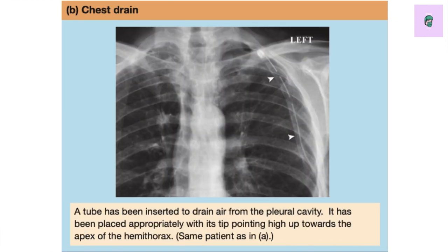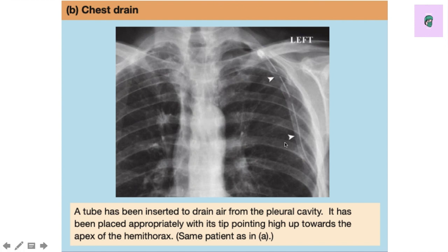Next is the chest drain. These days exams tend to ask a lot of equipment-related questions — pulmonary valves, aortic valves, mitral valves, and chest drains — to assess your clinical exposure. This has been more dominant since the August 2020 FMG exam. You can see the tip of the drain here, and the multiple holes indicated by the arrowhead. The tube has been inserted into the pleural cavity with its tip pointing upward toward the apex of the hemithorax to drain the pneumothorax.